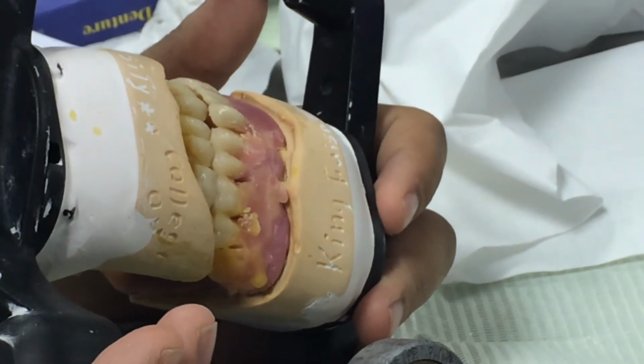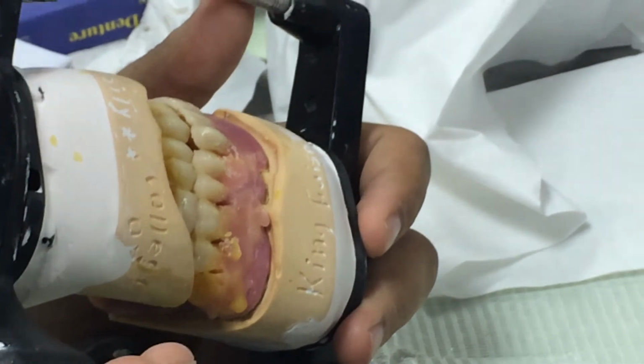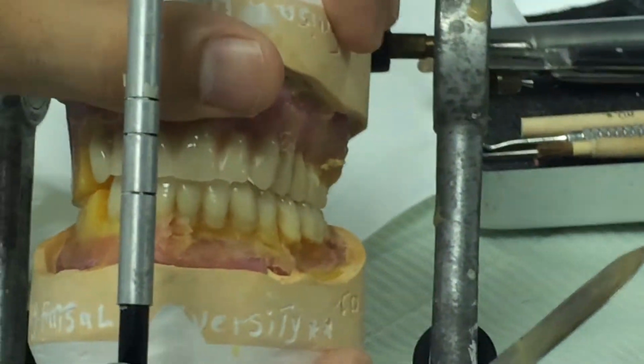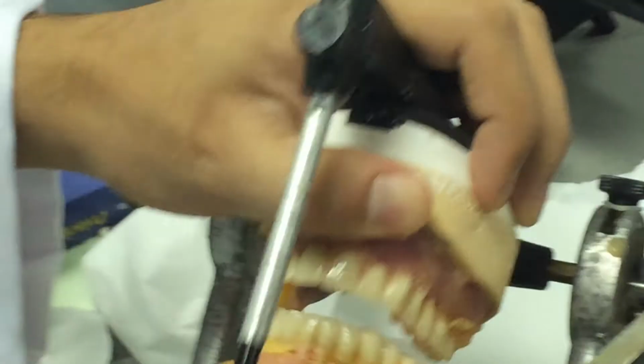It's too much, 3 millimeters is too much. So 2, 1.5, 2. Okay, guys? You see it? And you can see here that overjet. You can take out a little bit from this one to make sure that there is overjet.